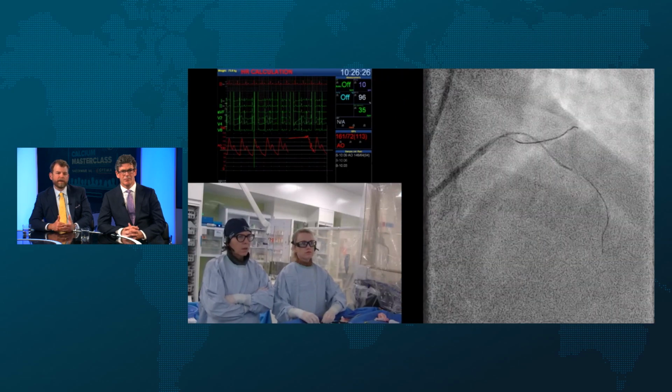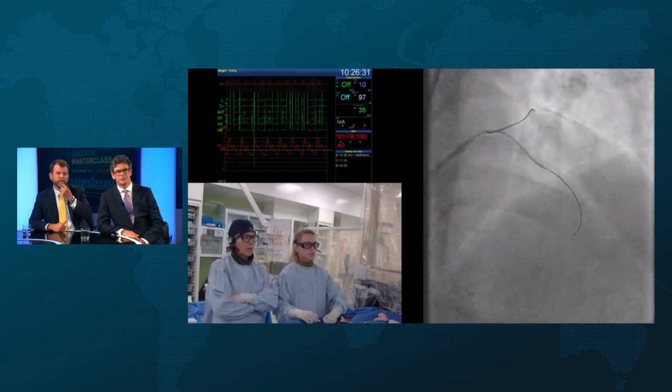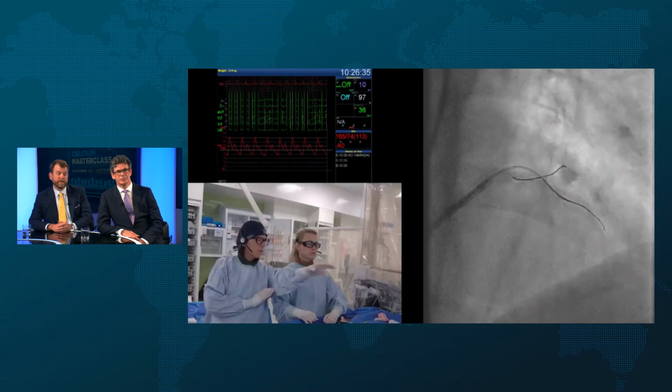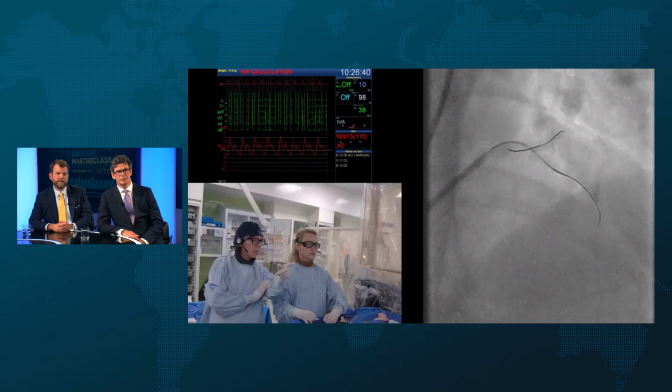One thing, if you had a challenge, would be to actually wire the septal, take a dual lumen in, and actually have the backup support to go through so that you're not swirling around in the aneurysm coming back. It can just be a challenge, right? Because that thing can be two, three, four times the size of the rest of the vessel.